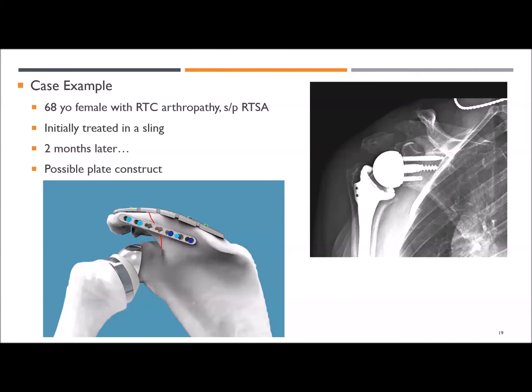So I would just caution you to really counsel her very well that there's a high risk of complications, both with regard to infection and failure of the construct. Based on what Bill's saying, the forces on this are unbelievable. In that particular situation, I think I used an Acumed plate.